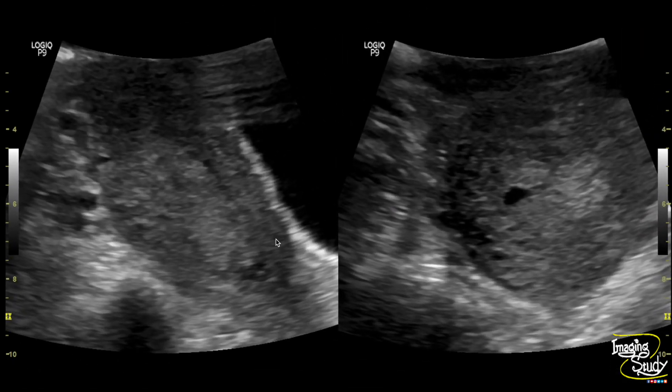Here is the magnified image. You can see on longitudinal and transverse section irregular mixed echogenic substances within the uterine cavity without any definite fetal pole or yolk sac.